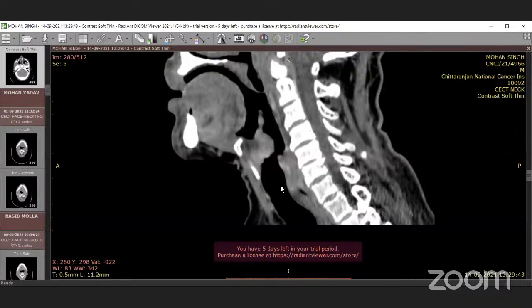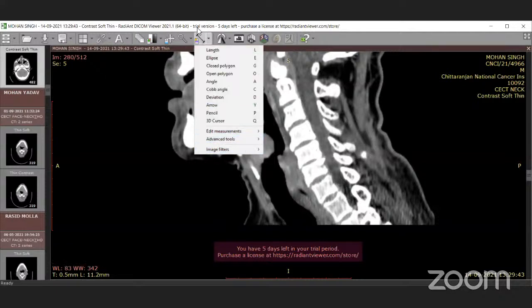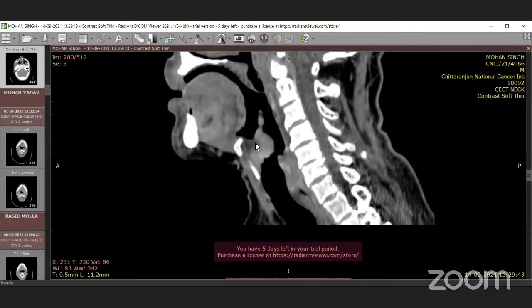Next question, Dr. So, would you give me a minute more to explain myself on this sagittal anatomy? Sure, oh sure, go ahead. I am probably stretching it too much. Okay. So this is the hyoid bone. This is the epiglottis. This part of the epiglottis is the free or mobile segment of the epiglottis.